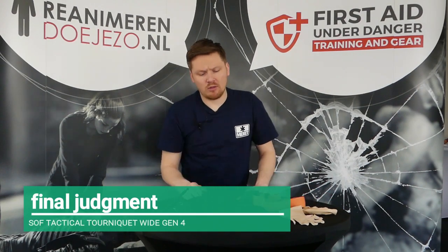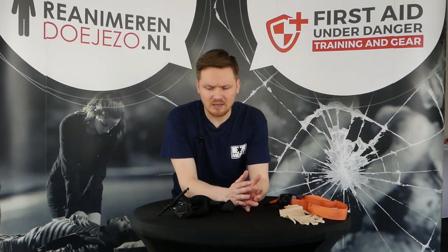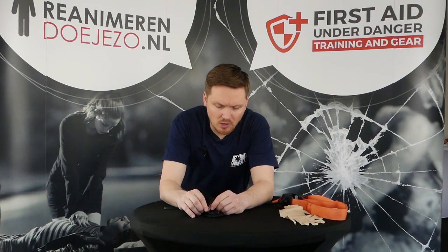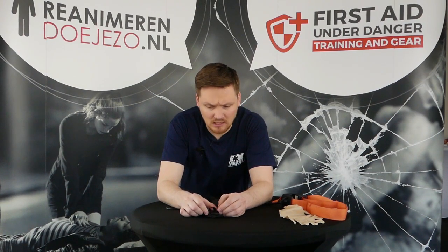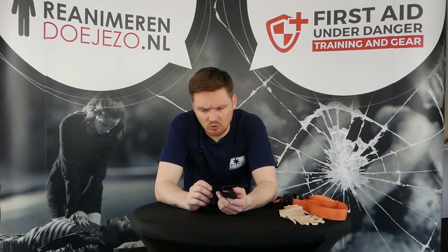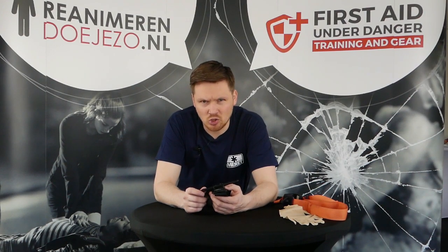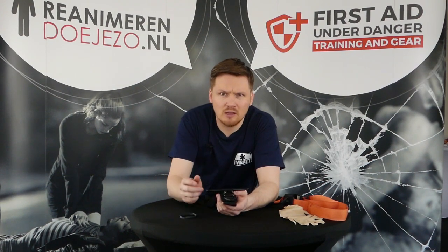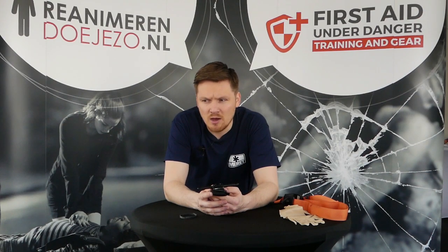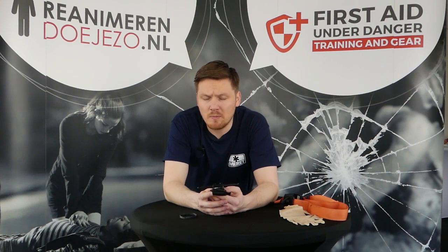I do believe that the SOF has made a major breakthrough by placing the buckle on there. The buckle is made from plastic, but that shouldn't really be a problem. The tourniquet rod is still made of airplane aluminum, so it will not bend as easily as a combat application tourniquet. And one of the major problems with the combat application tourniquet is a malfunction or deformation in your tourniquet rod. That is one of the biggest problems with the combat application tourniquet.